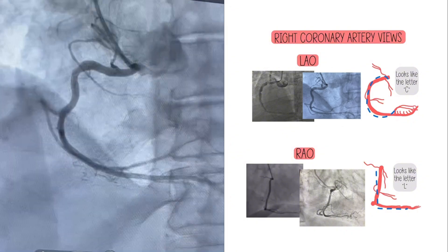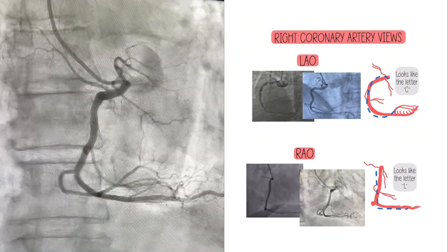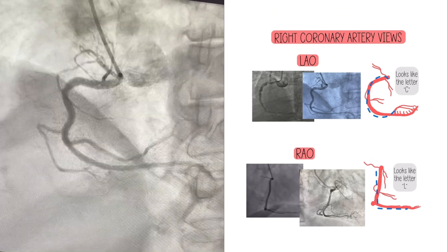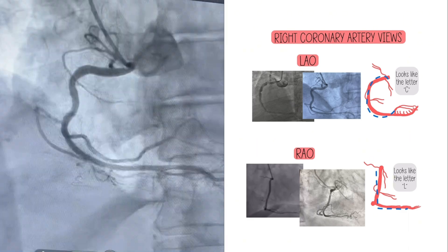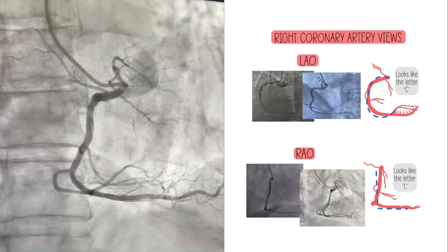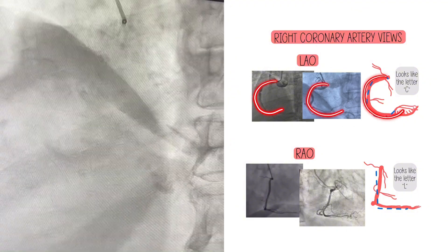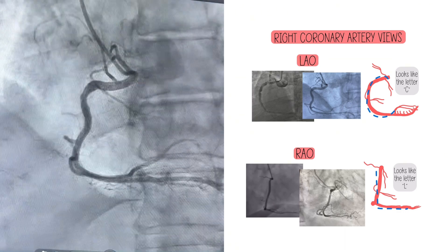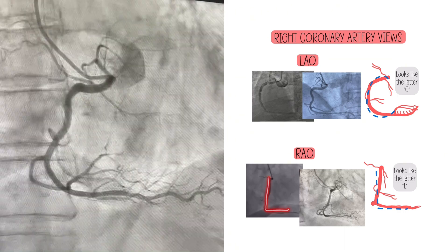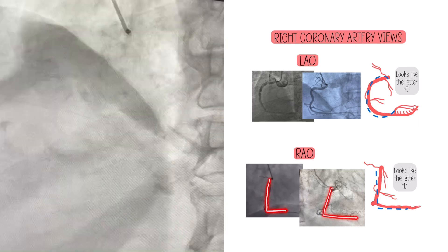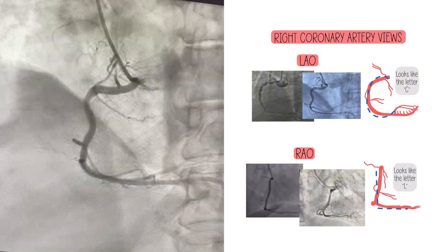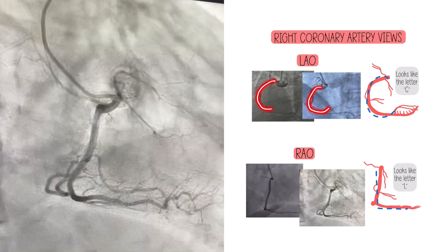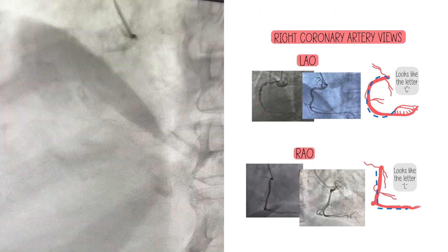In a straight LAO — left anterior oblique — the RCA is going to look like a C. I've given two different examples here, one of a diseased RCA and one of a relatively healthy RCA minus some tortuosity. You do have this kind of C shape. In an RAO, if you notice the difference in morphology, this one looks more like an L — a straighter L or one with a more acute bend — but you do have two straighter segments in the middle versus the curved segment you see in the LAO.